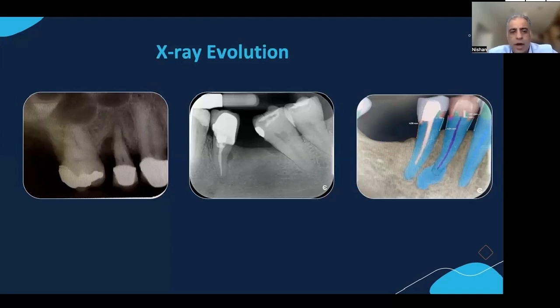And when I saw the patients for the first time, they were like, "Oh, we've got to come back to see our X-rays." And I said, "No, we've got an automatic processor." So they were a little bit, "Wow, things can be seen in 5 minutes."